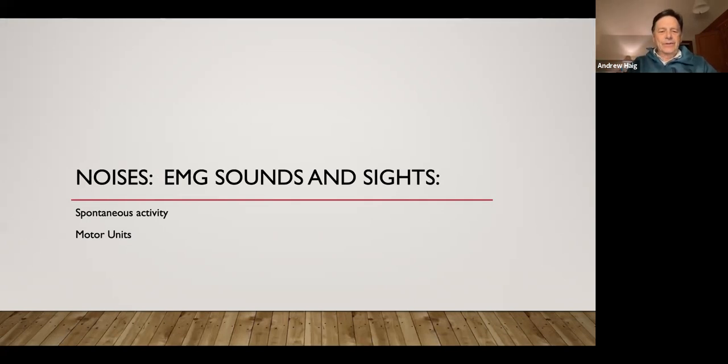There's two kinds of sounds that you want to get to know about, and you'll see them as well. There's spontaneous activity and motor units, right? So when you put the needle in the muscle, you listen and watch, and you jab around, little precise jabs. Remember, if you fill up more than a screen after you stopped inserting, that's increased insertional activity. It's lasted too long, right? And then after that, you can have other things that continue after you give a jab, or even when you're not jabbing. That's all spontaneous activity. Then there's the motor units. When you ask somebody to tense up, and each motor unit is what? One nerve cell and all the muscle cells it innervates, right? And we talked about polyphasic motor units, et cetera.